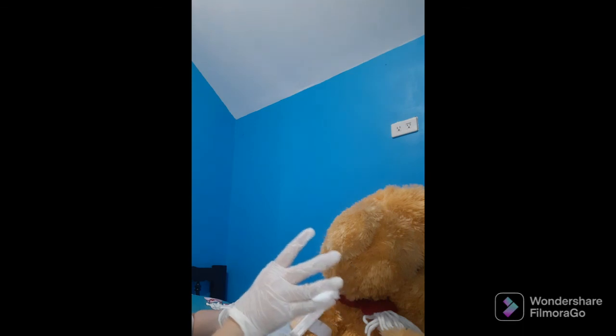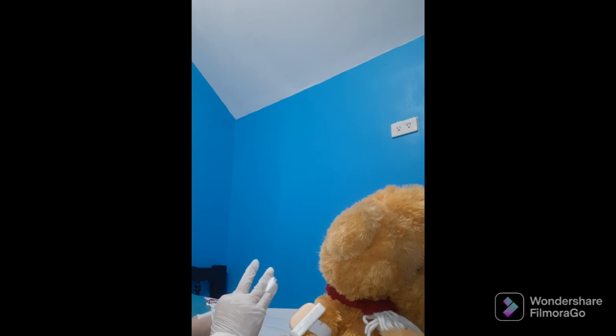Okay? And then, once na yung needle is inserted na, we need to move yung my dominant hand doon sa end ng plunger. Or meron namang mga nurses na nakikita nilang mas madali if yung i-move nila yung non-dominant hand nila doon sa barrel of the syringe and yung dominant nila doon sa end ng syringe.